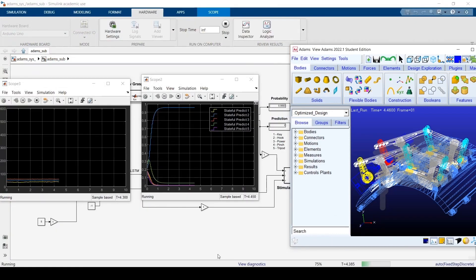Once we initiate a grasp here we'll initiate the pinch grasp. We see that a prediction is made and it correctly predicted the grasp and then the output is sent to the Adams model.